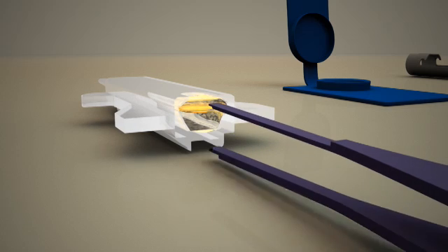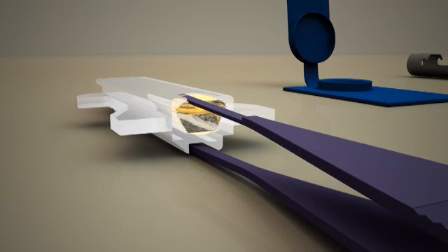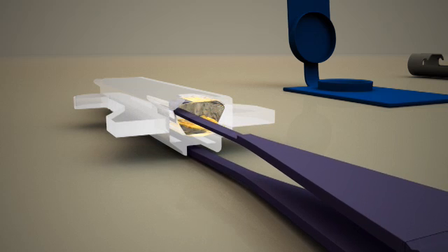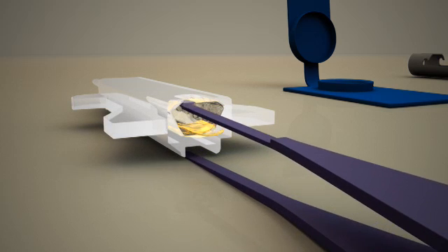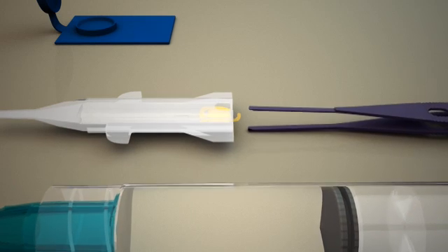Open the forceps and use the upper blade to carefully press the lens to the base of the cartridge.